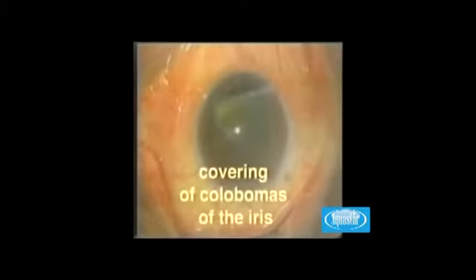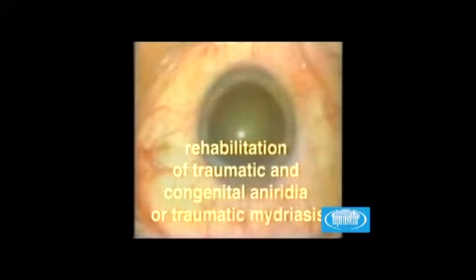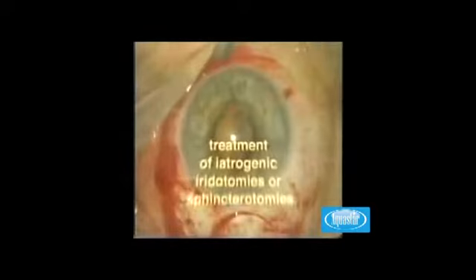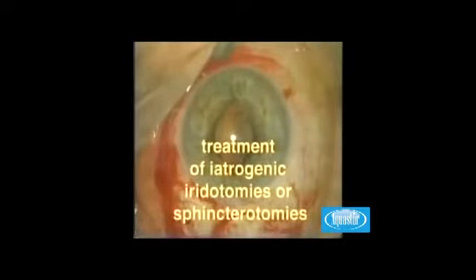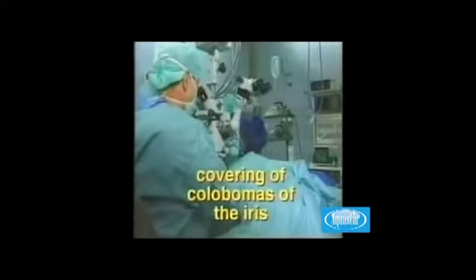Covering of colobomas of the iris, the rehabilitation of traumatic and congenital aniridia or traumatic mydriasis, and the treatment of iatrogenic iridotomies or sphincterotomies. You'll now see examples of surgery for these indications. Complicated anterior segment conditions exist in all cases.